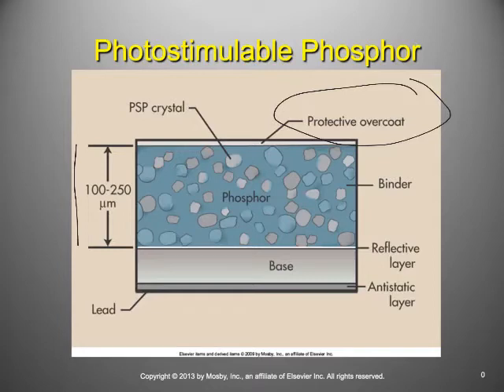And these crystals inside of the phosphor are kind of like the sensitivity specks inside of the film. They're all throughout this phosphor plate, and they're very small, like 3 to 10 micrometers in measurement. So an individual crystal might be 3 to 10 micrometers.